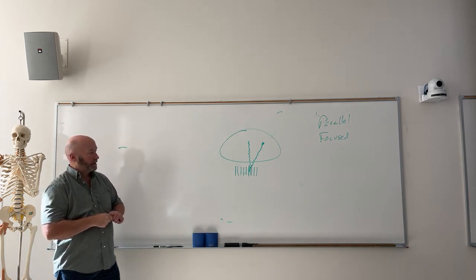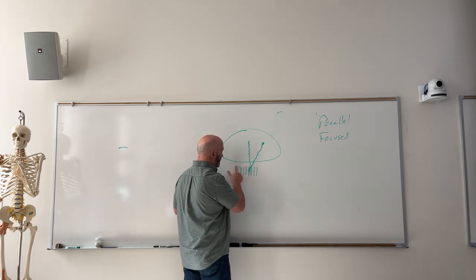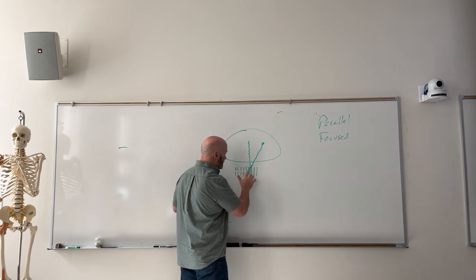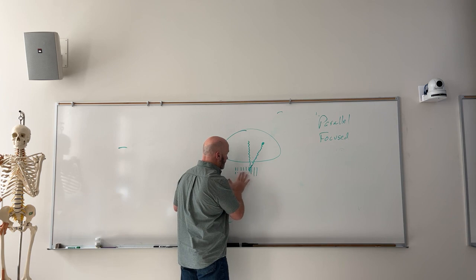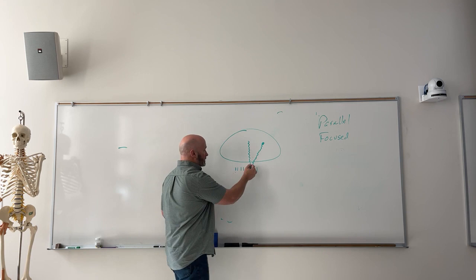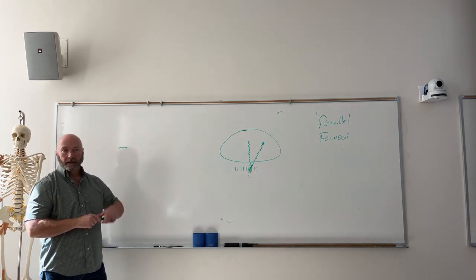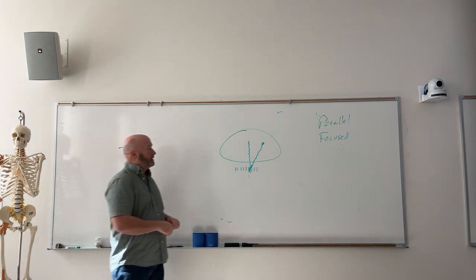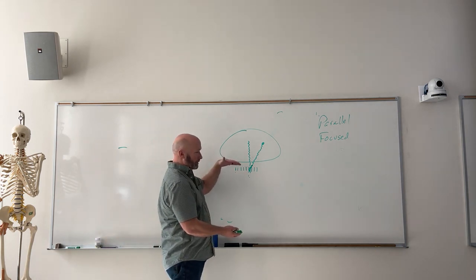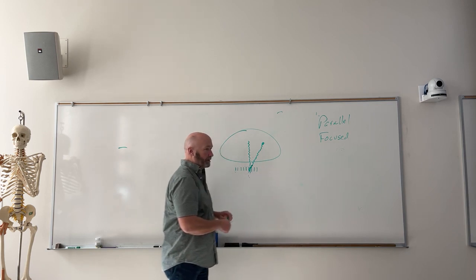Answer is yeah. Okay. So what if then we've got this grid and we cut it down to this thick? Now would that X-ray photon make it through? The answer is again, yes. Yeah, it would. All right, so what we need is a balance between the thickness of the grid and the length of the grid strips and how close they are together, okay?